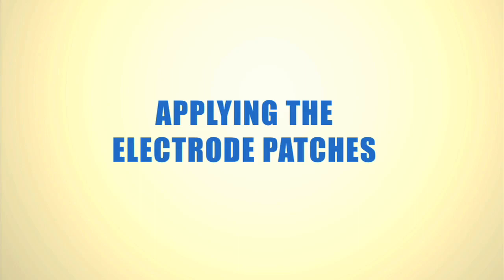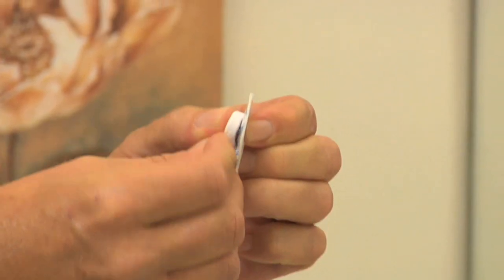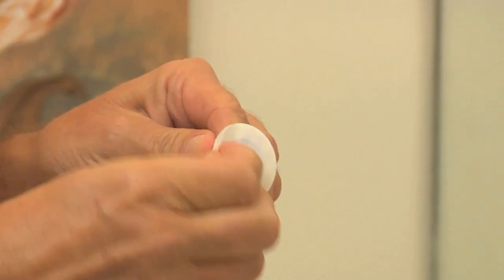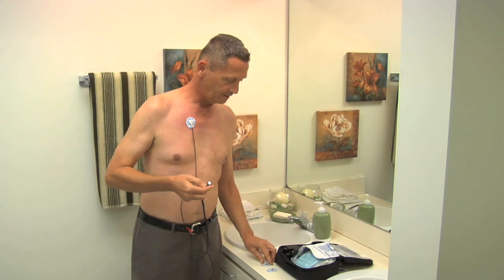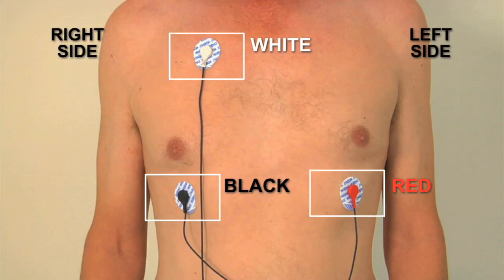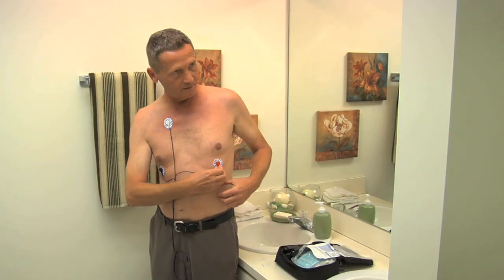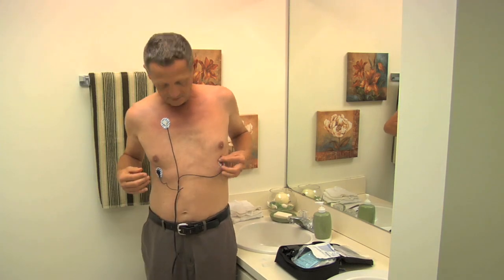Apply the electrode patches. Find the patient cable. Snap the white wire onto the electrode, peel it from the plastic backing, and apply it to your chest as shown. Repeat the process for the remaining wires. Remember, white on right when applying electrodes — this will help you remember to always place the white electrode on the upper right side of your chest. We recommend that you change your electrodes every two days, moving their location slightly to prevent skin irritation.